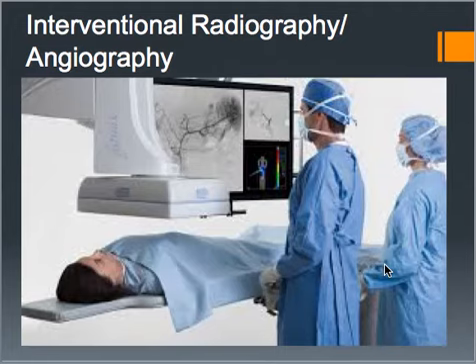Interventional radiology or radiography or angiography. The terms are kind of used interchangeably, but they do have slightly different meanings. So, interventional radiology or radiography is the specialty. So, that's kind of the modality that it is. Angiography is the process of taking images of blood vessels.